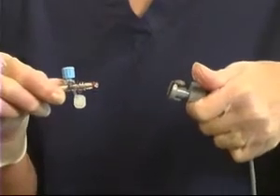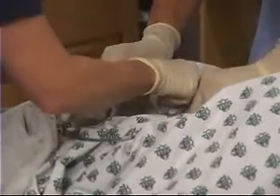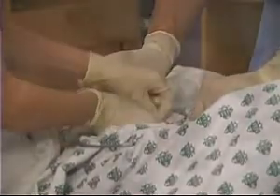To prevent catheter movement, attach the Koala to the thigh of the patient using the adhesive patch. Remove the adhesive backing, pinch the patch around the Koala, and place it on the inside of the patient's thigh as close to the introitus as possible.